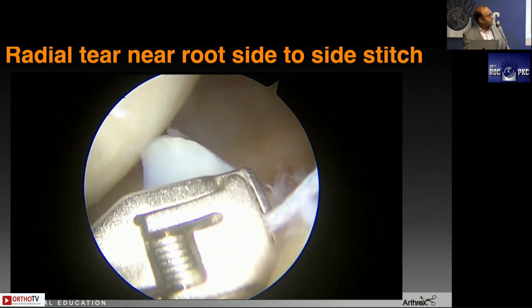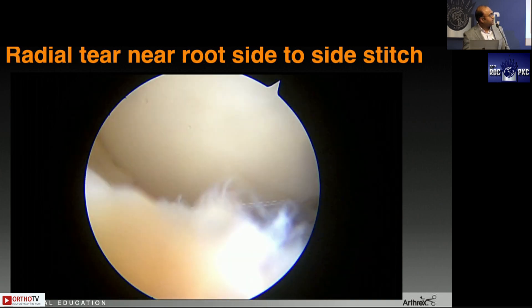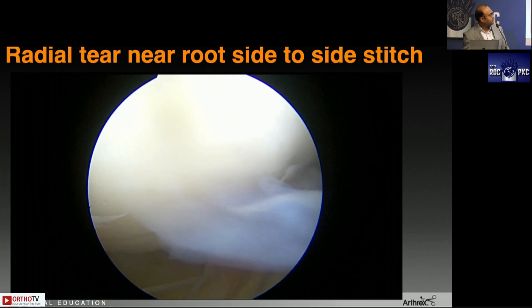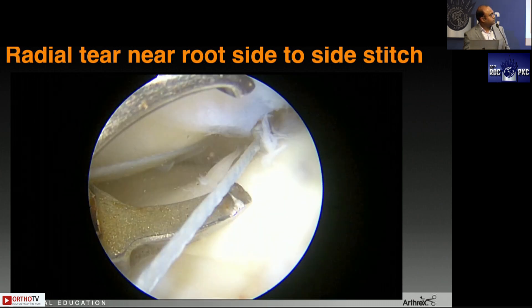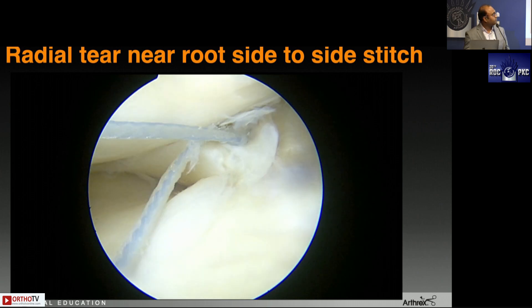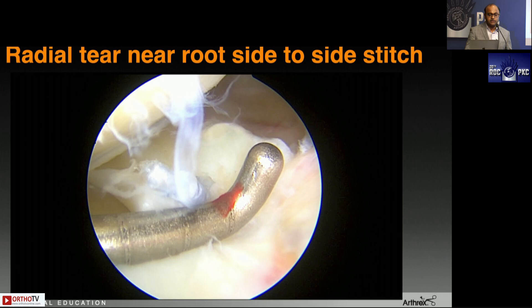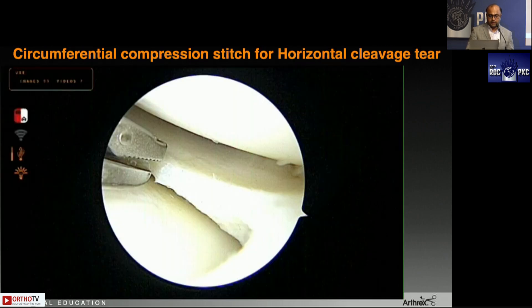You're taking the bite through that flimsy lateral meniscus root flap with a zero number fiber wire, then taking a transpatellar tendon portal for suture management. The superior surface suture is stationed up and the inferior surface suture is loaded again. You take a bite through the main bulk of the lateral meniscus, place a passport cannula, retrieve both sutures, and tie a non-sliding knot — if tissue quality is poor, be careful and use a non-sliding knot. You can additionally put an all-inside device to secure the meniscus to the capsule for a very strong construct.